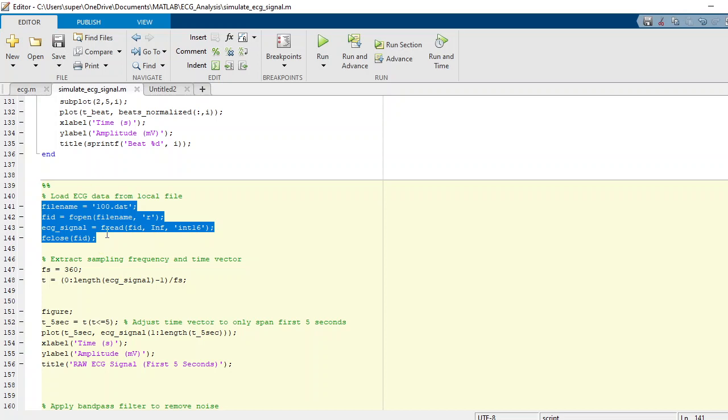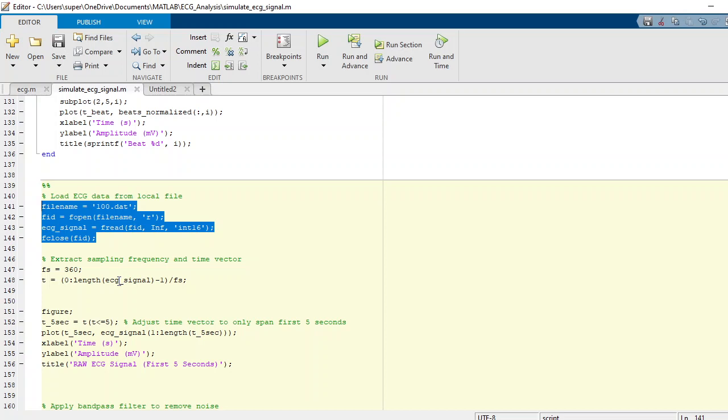The sampling rate is 360, and what I'm doing is making a time vector with zero and the length of the ECG signal minus one, divided by Fs, because you know that time is one over frequency. So our frequency is 360, so time would be the total duration divided by the sampling frequency.